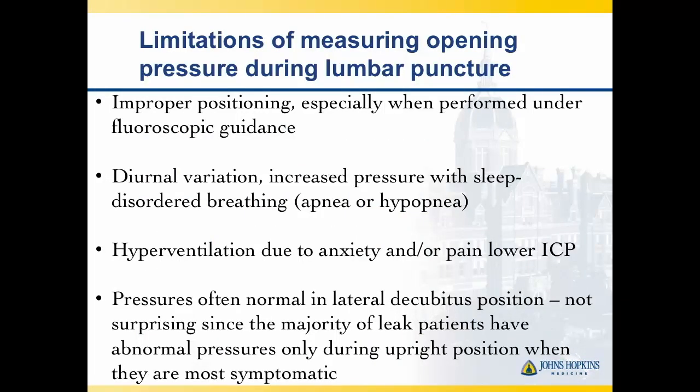We all know about the limitations of measuring opening pressure during a lumbar puncture. There's problems with positioning, there's known diurnal variation. A lumbar puncture gives you just a spot measurement of the pressure, but ICP varies quite a lot between the day and the night, especially all our pressures are higher at night, which has got to do with the supine position. We probably make more CSF at night, according to some MRI studies, and the effects of sleep-disordered breathing elevate ICP even further at night.